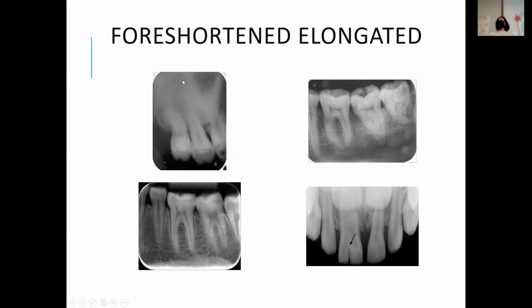Yeah, Liddy? Yeah, you can see some sinus. This is actually the zygomatic process, which we'll talk about more later. Sometimes it looks a lot like the sinus, but there are some key differences that you guys will be able to pick out, no problem. But yeah, some of this is just obscuring it. But the angle is one of the biggest things.